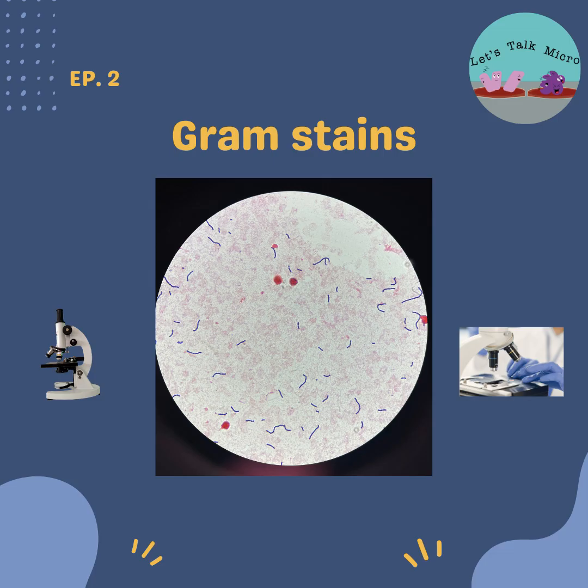When you set up something that is not a gram positive cocci on a Vitek GP card, it gives you Kocuria as the ID. That's like the default ID. I have seen techs release this. So when you get a Kocuria, make sure you investigate, do a gram stain, and find out if you have a gram positive cocci or not.